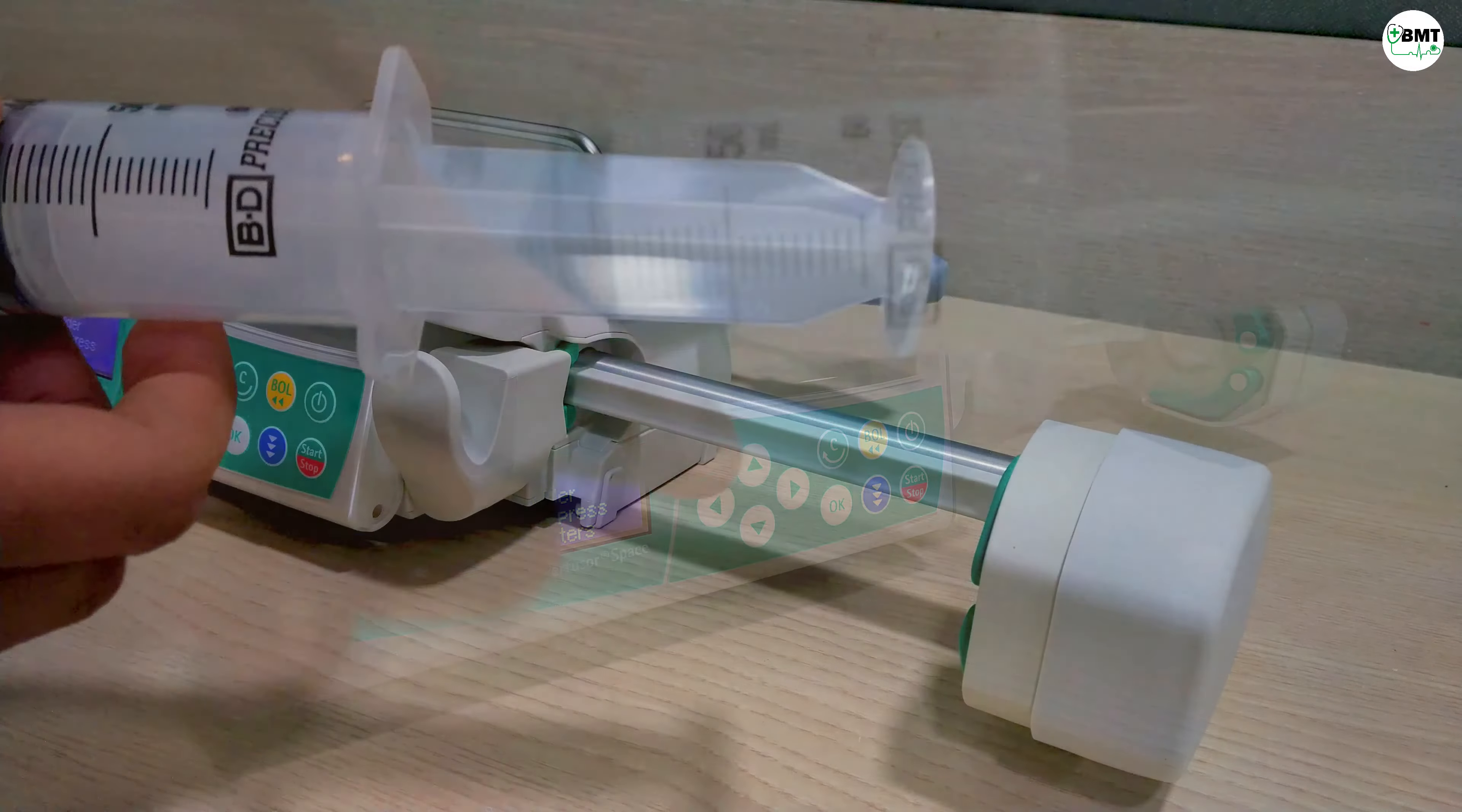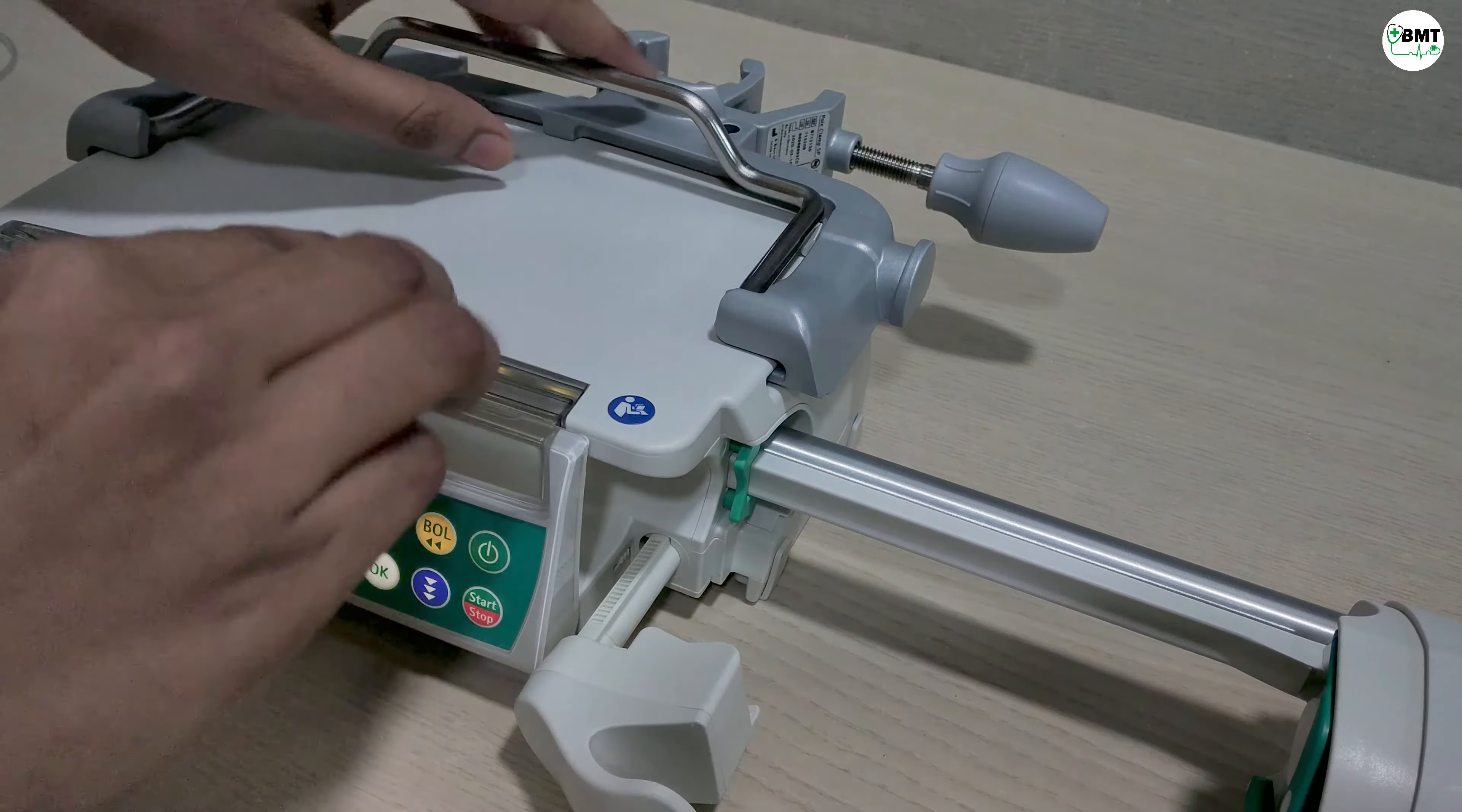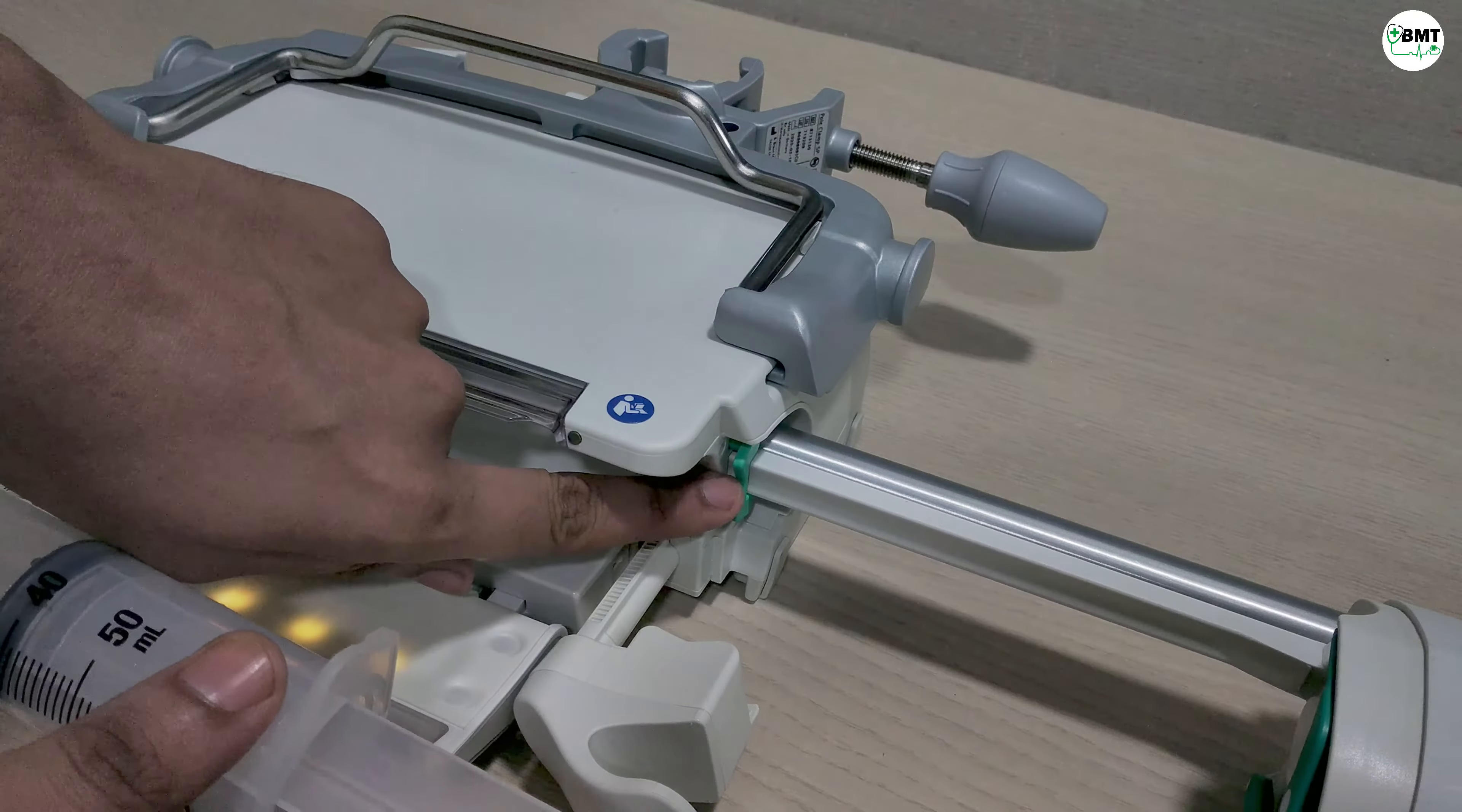Now how to load syringe. This is a 50cc syringe. Open syringe holder, this and then this. Then insert this syringe over here.